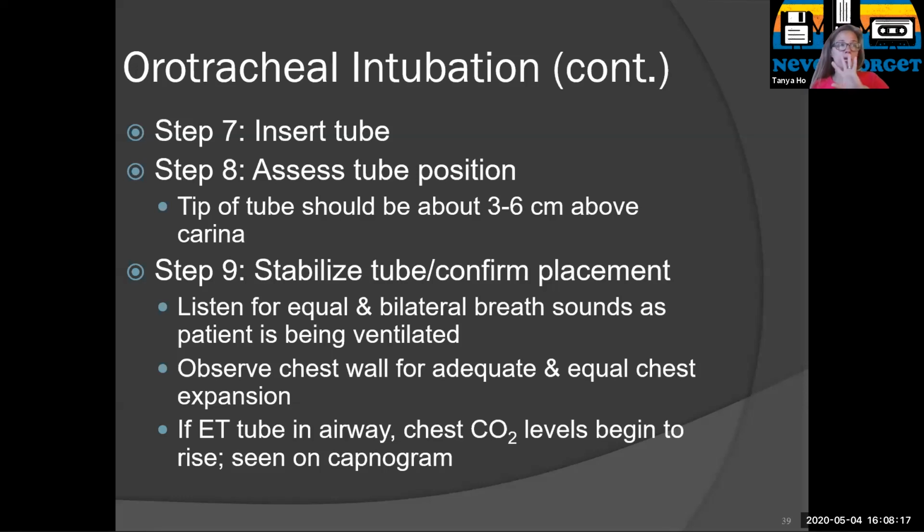So you definitely, and by the way, when you're doing the manual ventilation part, hopefully you're doing a good job, and go back and review good technique, because again, I cannot stress enough how important good technique is for manual ventilation. But my point is that during that time, even with really great technique, some air will probably still go into the stomach. Okay, so who knows how much air is in there. And so you absolutely want to try to listen over the tummy first.